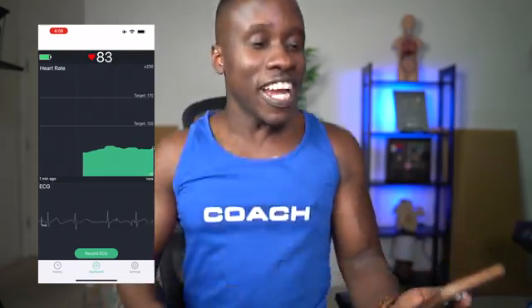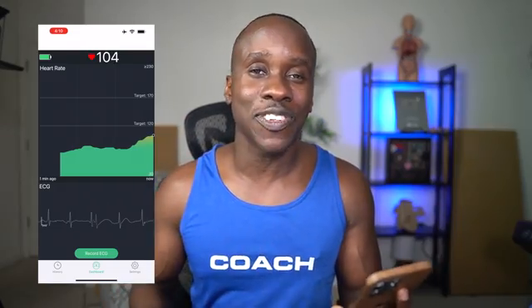Let's see if I can get myself worked up really quick. I'm going to jump around and see if that increases my heart rate. It's going up: 85, 87, 88, 89, 90, 96 — we've got to 100! So you can visually see it and see the actual number. At the bottom you can see that ECG, showing the entire waveform. There's a section where you can record the ECG — if you click that button it will record directly onto the device, though it can only record a maximum of 30 minutes on the device itself.